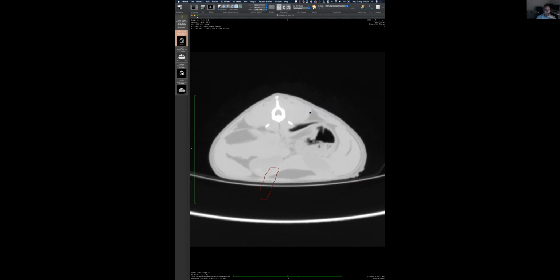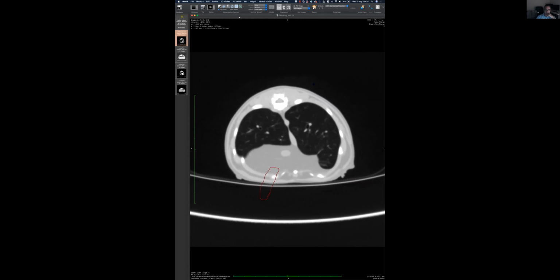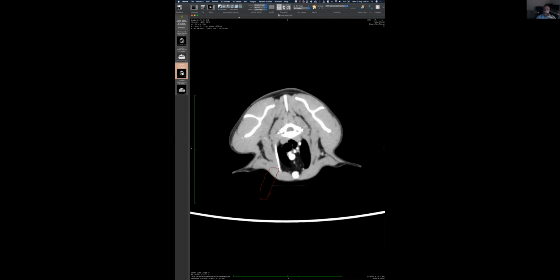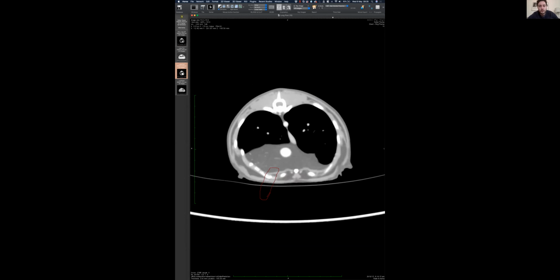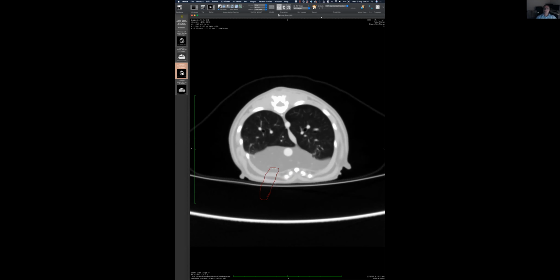Okay, is it helpful? It'd be really interesting to see the contrast CT of that. Because this is contrast. It is contrast. Yeah. Right. I'm pretty sure. Oh no, this one is both. Yeah, there we go. You want me to reconstruct? Oh, I have these tools in here. Okay, let me. Oh. It appears to be a soft tissue mass as I see it.